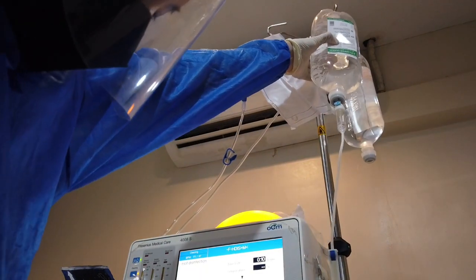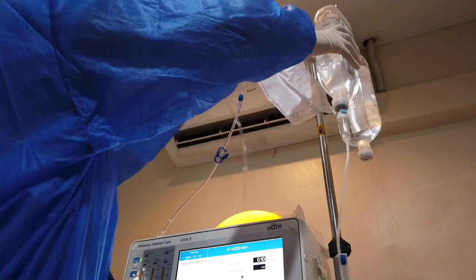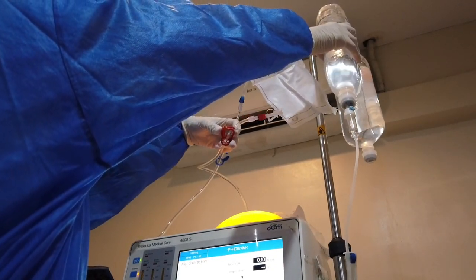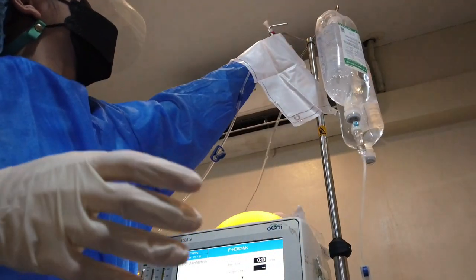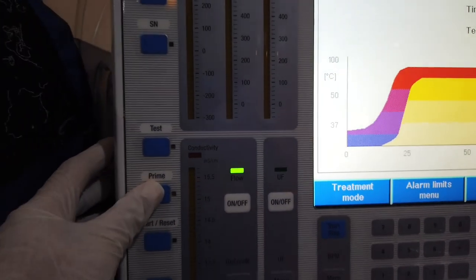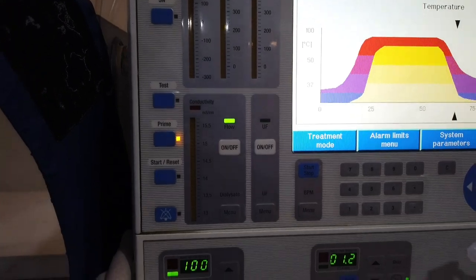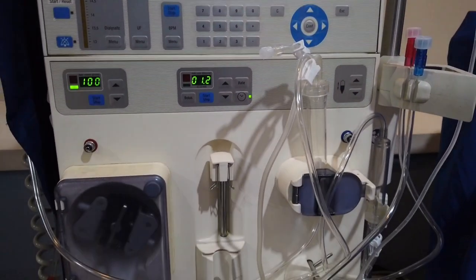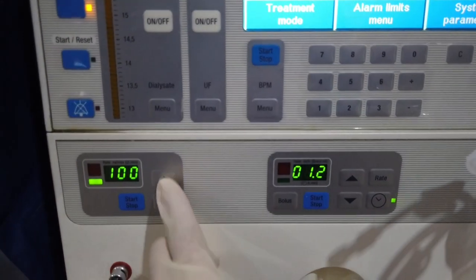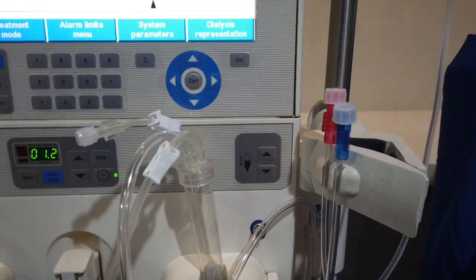Make sure the roller clamp is open and press the IV bag to assist in pushing the priming solution. Once it reaches the patient's end line, close the big arterial clamp. Then prime the dialyzer end part via blood pump. Blood pump is in red light, so long press the prime button to activate it with the default 100 ml per minute blood flow rate. Then start the blood pump. You can increase the blood flow rate, and once the priming solution reaches the dialyzer end part, stop the blood pump.